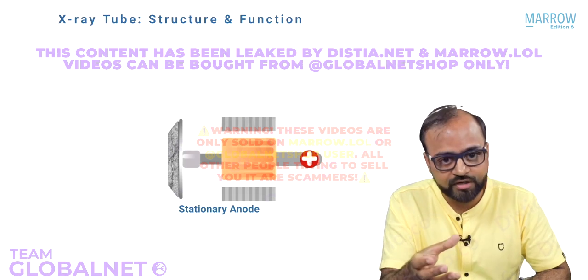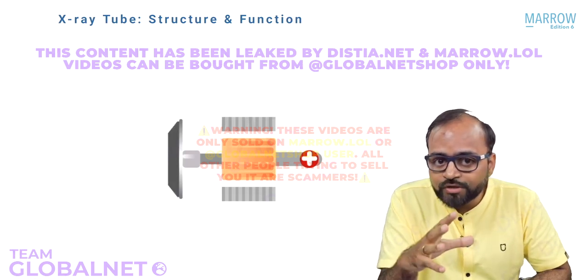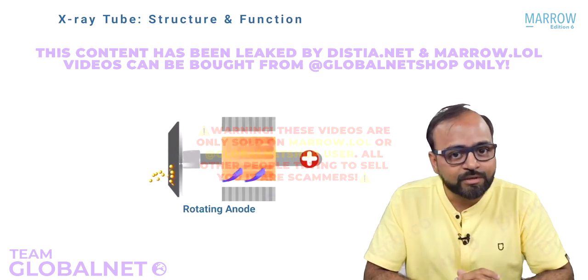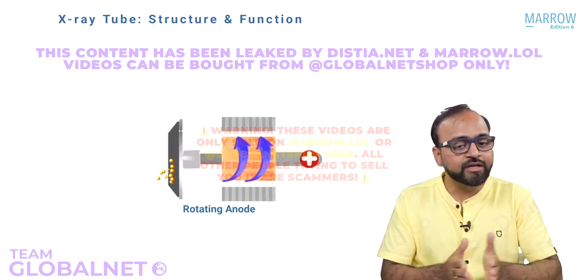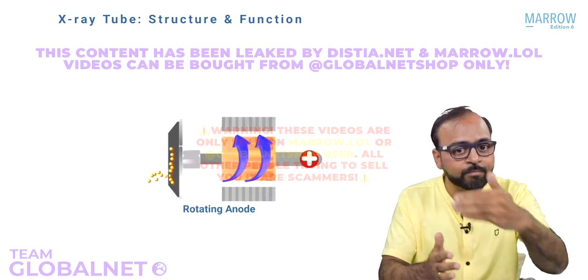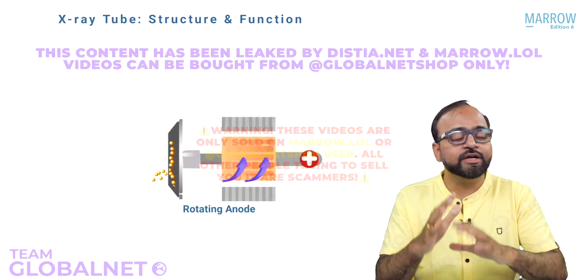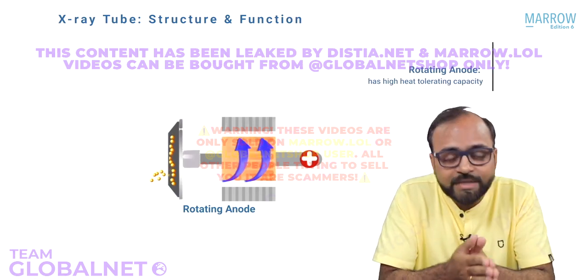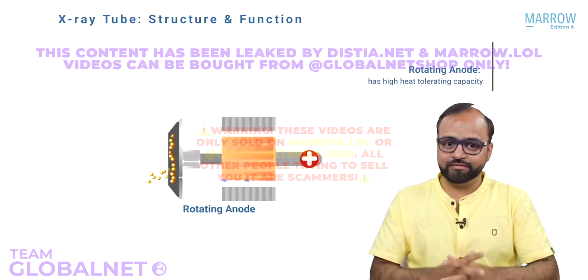The X-ray tube malfunctioned, right? But nowadays what they do is, instead of using a simple disc, it is a rotating anode. Can you see the animation there? The anode is rotating. Because it is rotating, do you realize that every time the electrons are hitting a different part of the disc? Therefore, it is not easily deformed. It has a very, very high heat tolerating capacity and a much longer life.